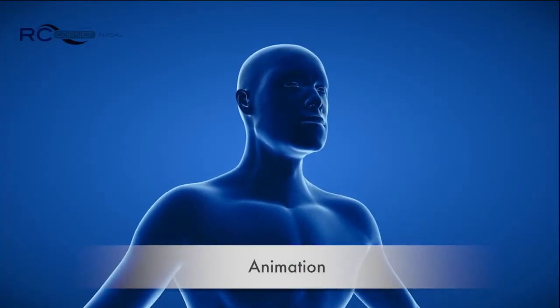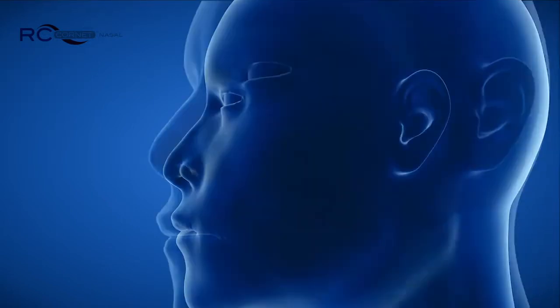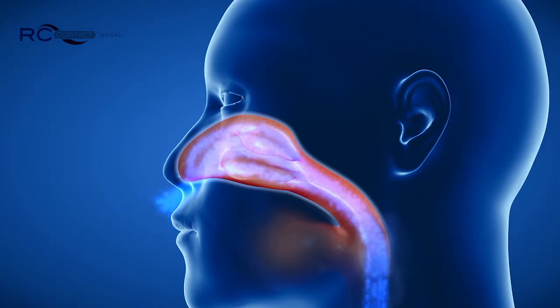Please be aware that this animation shows the anatomy of the upper airways only in an abstract manner. The nose filters, humidifies and warms the air inhaled to prepare it optimally for further processing in the lungs.